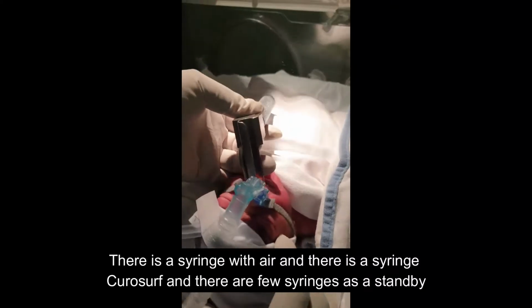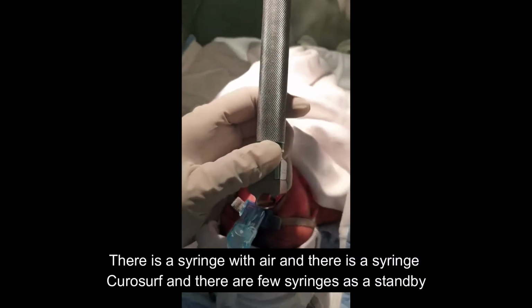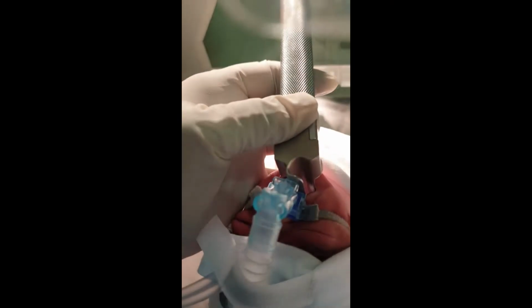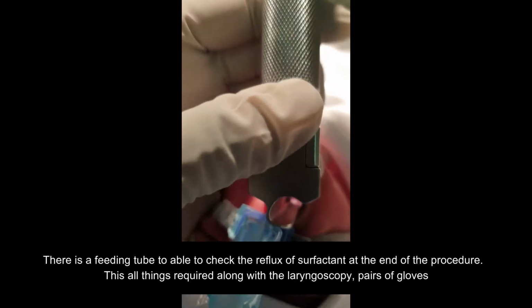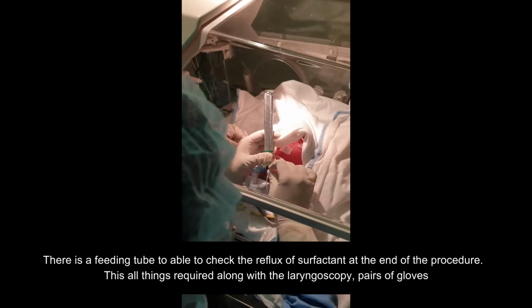There is a syringe with air and there is a syringe with Curosurf, and there are a few syringes as a standby. There is suction apparatus ready, and there is a bag and mask and intubation tray for any eventualities, lest it may happen. There is also a feeding tube to check the reflux of surfactant at the end of the procedure.